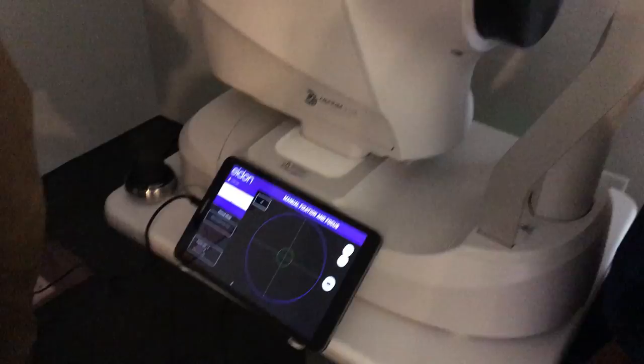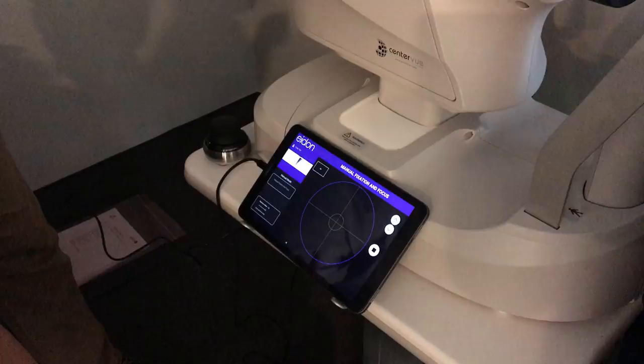All right, if you wouldn't mind positioning here. I'm going to hit the go button — it's going to get focused in as close as it can without actually taking the picture.